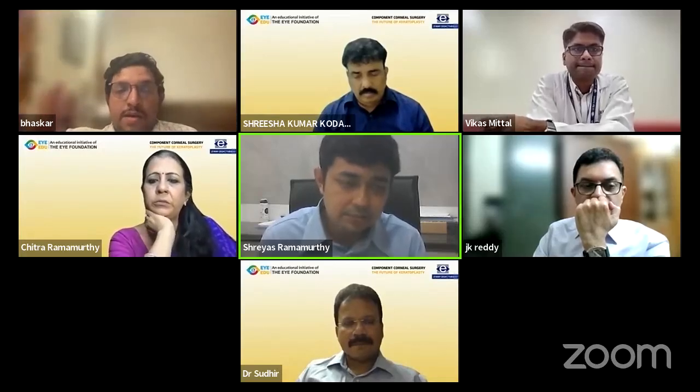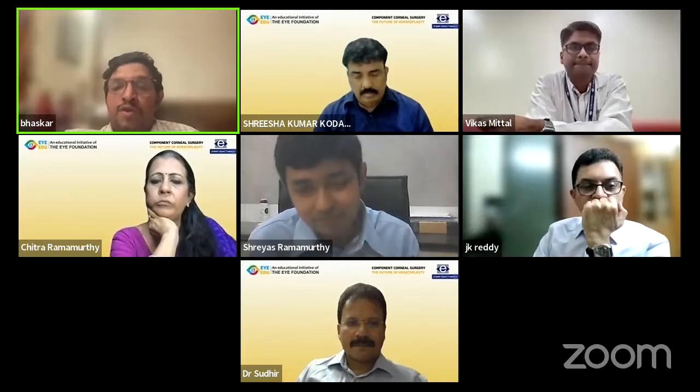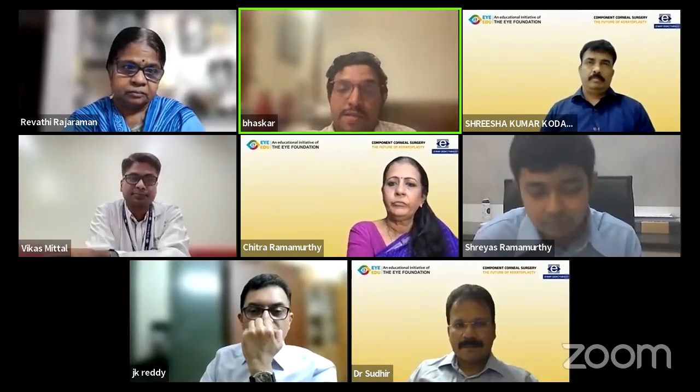If I could just add a point, Doctor. Yes, Shreyas. It's important also to have the verticality of the edges. Most of the time with DALK, you end up having a shelving edge where your graft apposition becomes a bit of an issue, especially if you're doing a manual DALK, you still have a little bit of residual tissue, and you're using therapeutic grade tissue because you feel your endothelium is not required. So that significantly matters. The bed is not as good, so you need to be very clear that you are able to maintain your anterior edge. For that, the verticality of the edge is definitely important.